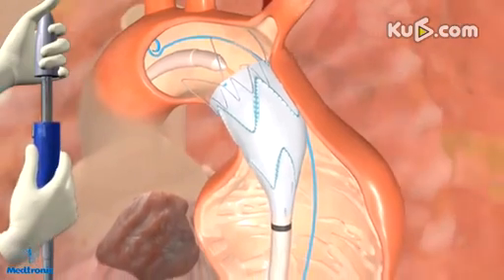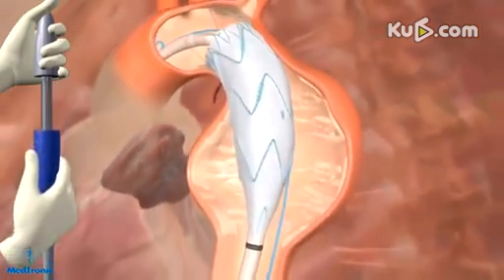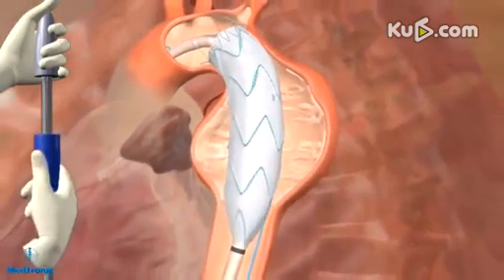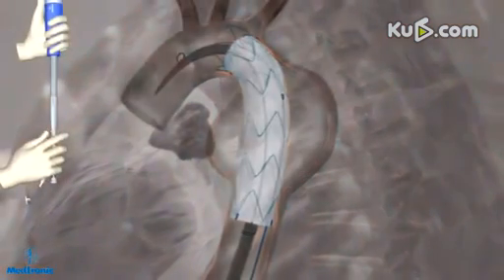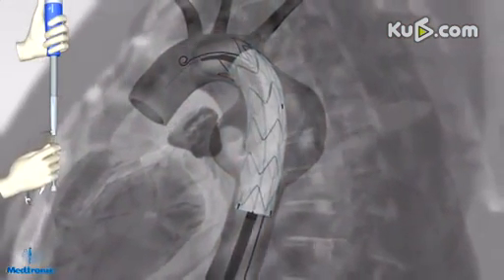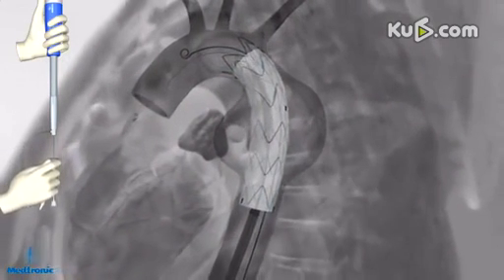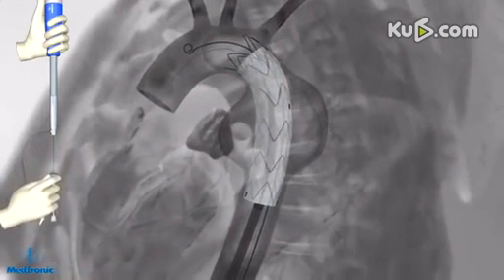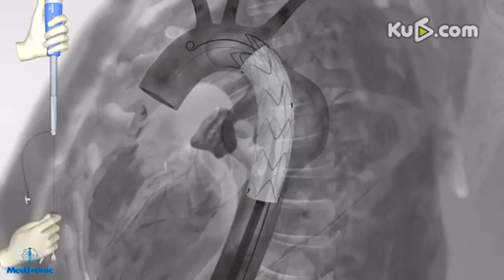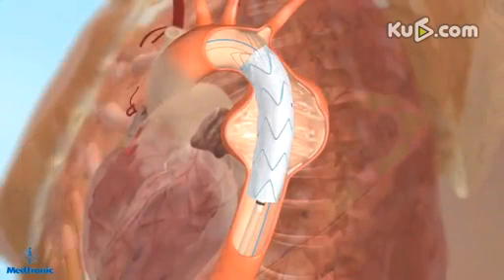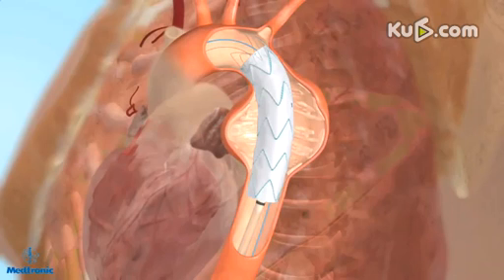Verify that the proximal end of the stent graft is placed correctly, then hold the delivery system steady and continue to rotate the external slider until the distal spring is completely deployed. To remove the delivery system, depress the button on the quick disconnect to retract the tapered tip into the graft cover. Using continual fluoroscopy, watch the top of the Talent Thoracic StentGraft while slowly pulling back the tapered tip into the graft cover of the Accelerant Delivery System, reestablishing the smooth transition of the tip with the cover. Hold the tip in place as the whole catheter is withdrawn.